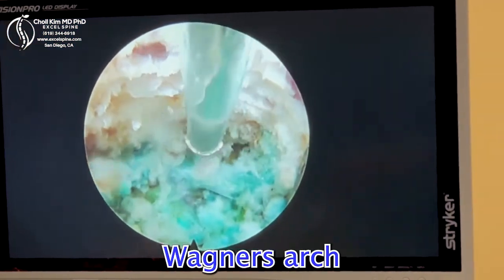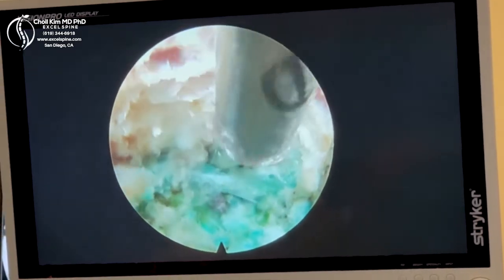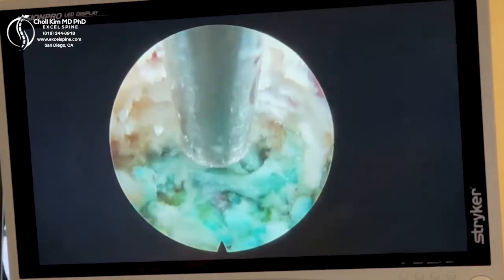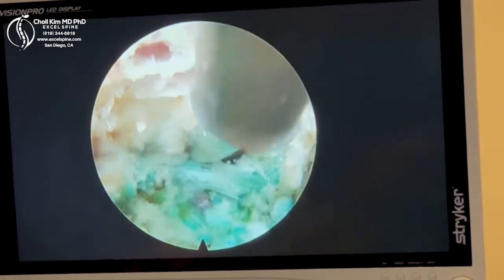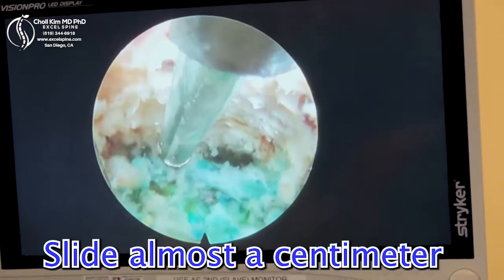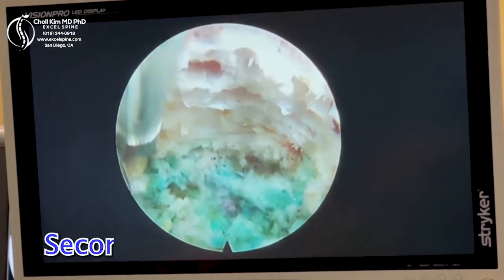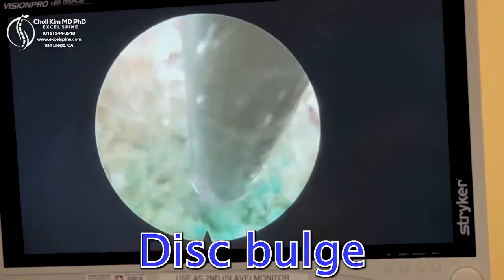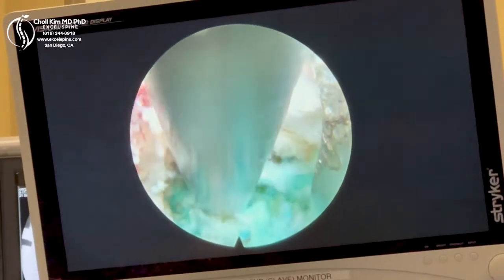When I try to go up here like this, it's stuck — because normally the dural tube should have a padding of fat around it that has anti-adhesion properties. That way the dural tube can pulsate, and when you move your legs up and down the nerve slides almost a centimeter. When it's stuck like that it's very bothersome, sort of like having tape on your neck. It's a secondary sign of inflammation. There's a bulge right there. Okay, I'm in the defect — it is completely empty right there.